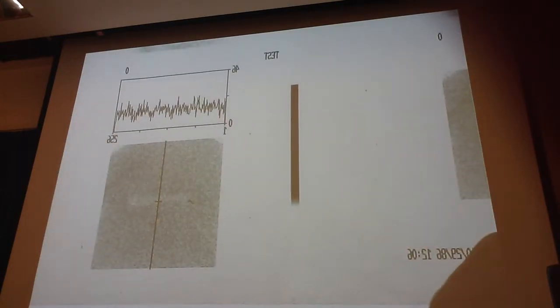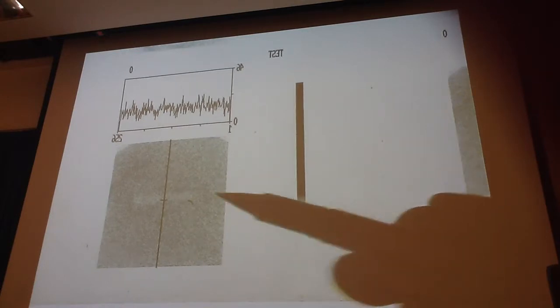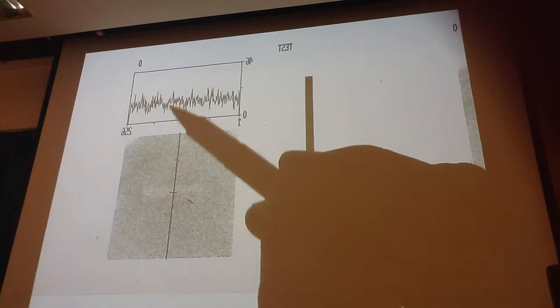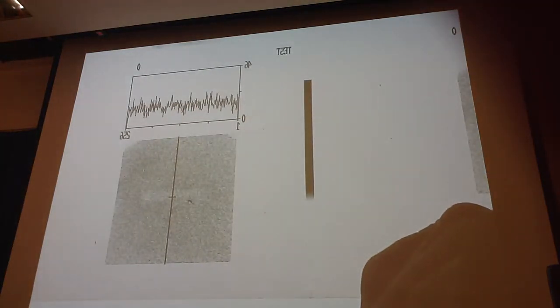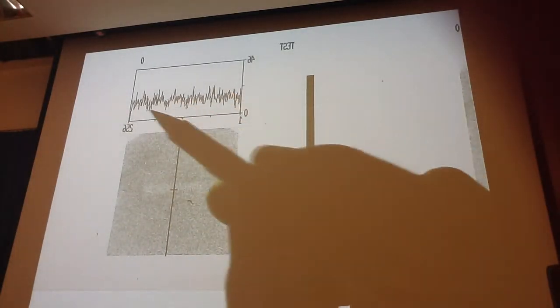The other thing I wanted to show you is this. Okay, how statistics play a game with us here. This is the Fourier transform of a low count image. Okay, can you guys see the object in there? I mean, you can see it here. But do you see it here?